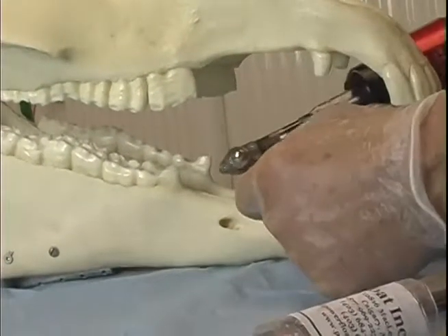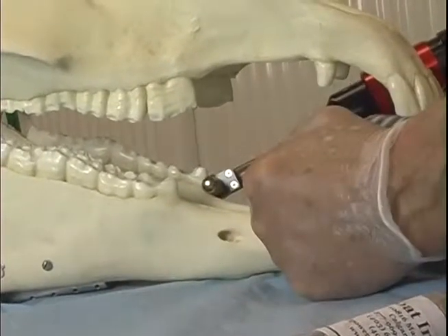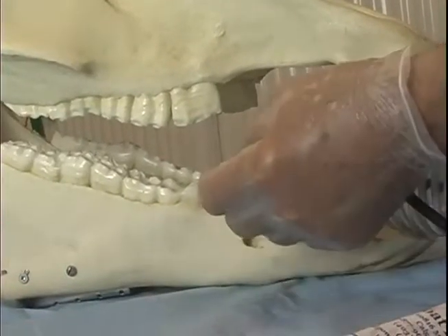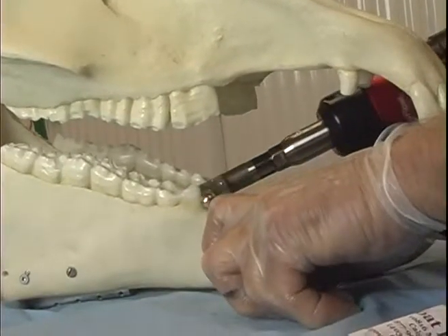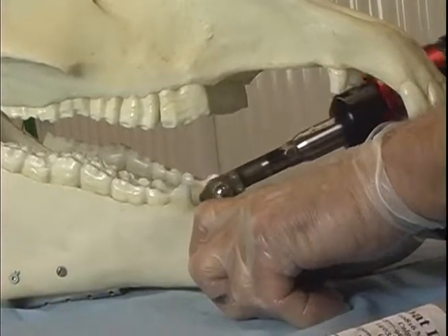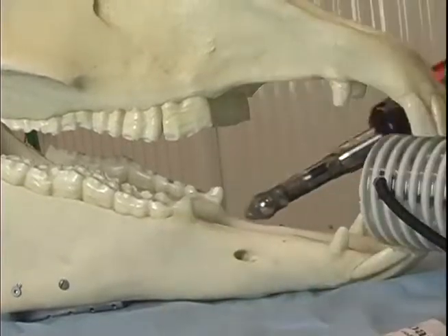So doing this, I simply grab onto the tongue, grasp the tongue, pull it sideways. This right angle pushes the cheek out, which tightens the frenulum, and I can start right at the gum line, and I can smooth this knife edge of this tooth out. Then I simply flip the tongue over top of the shaft, and then I pull the cheek out with this finger, and I come across here and I do this one. And this way the wheel is always turning towards the tooth to get the bit seat.